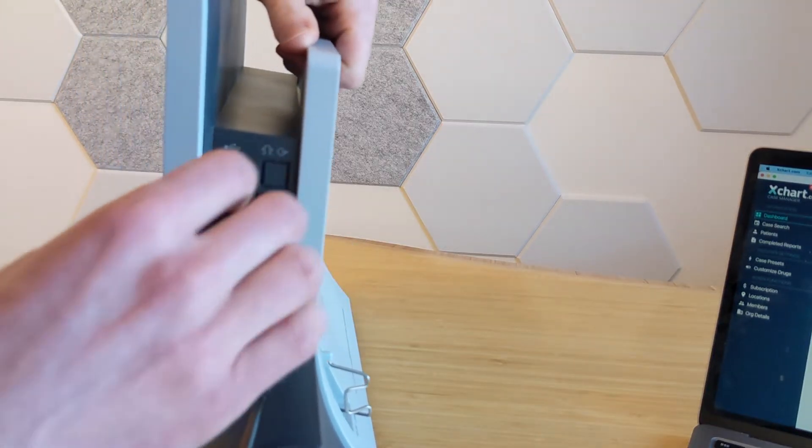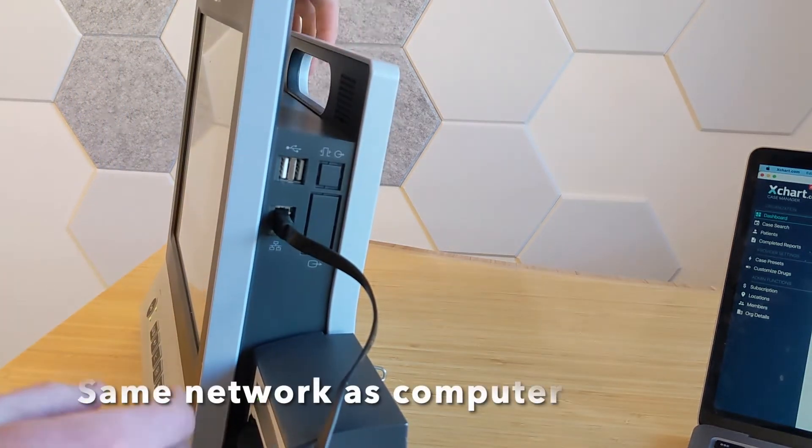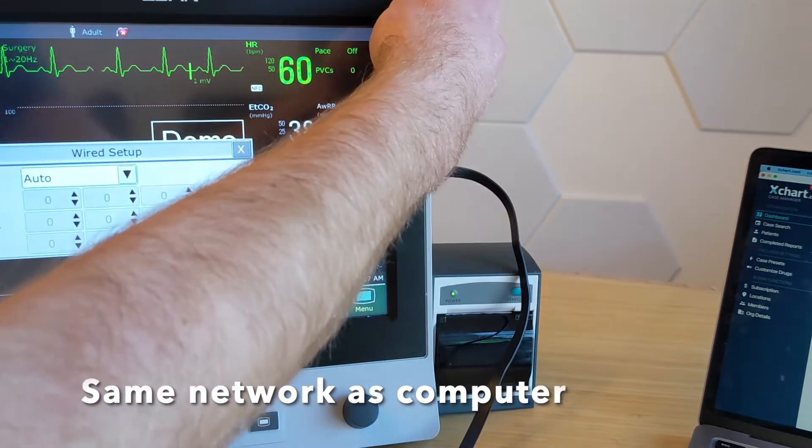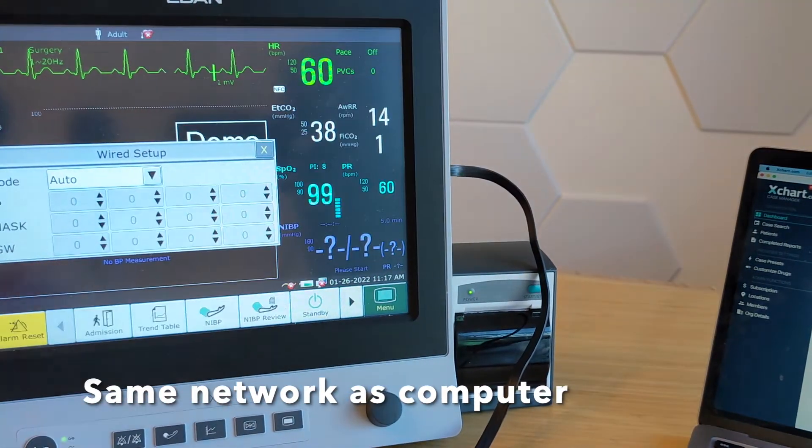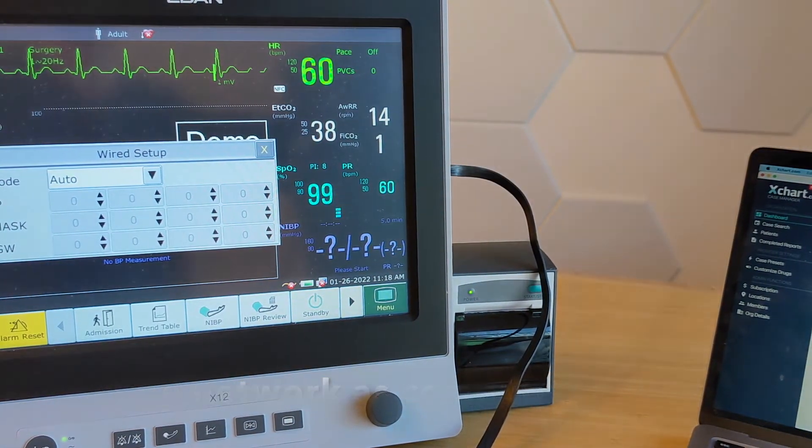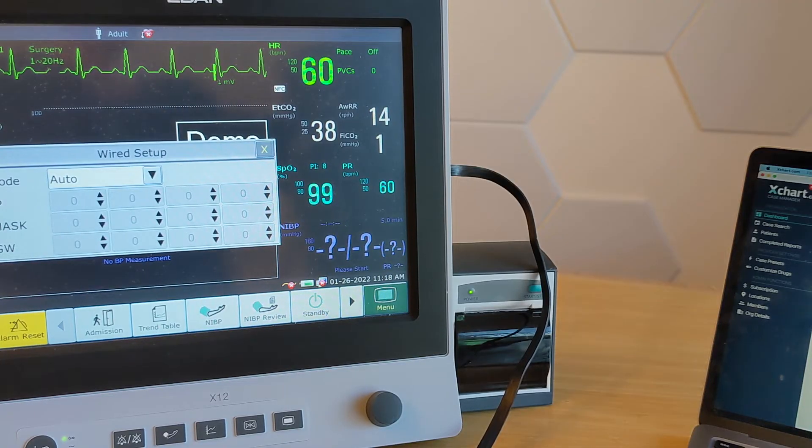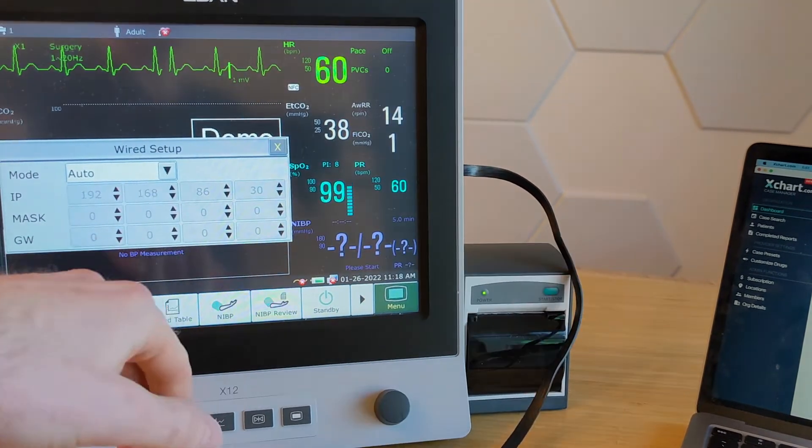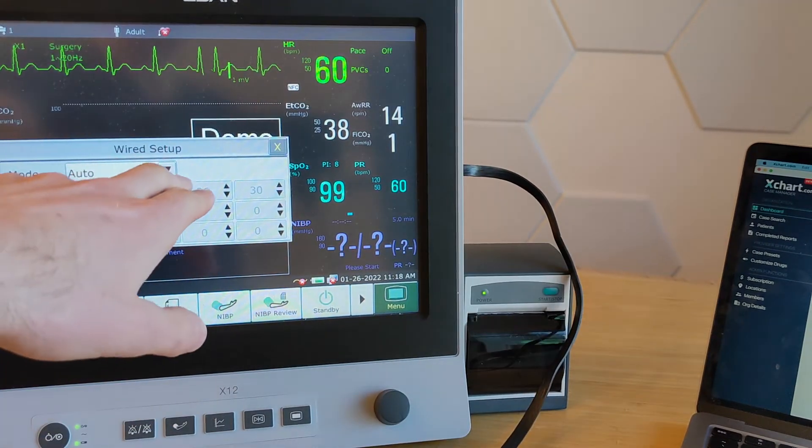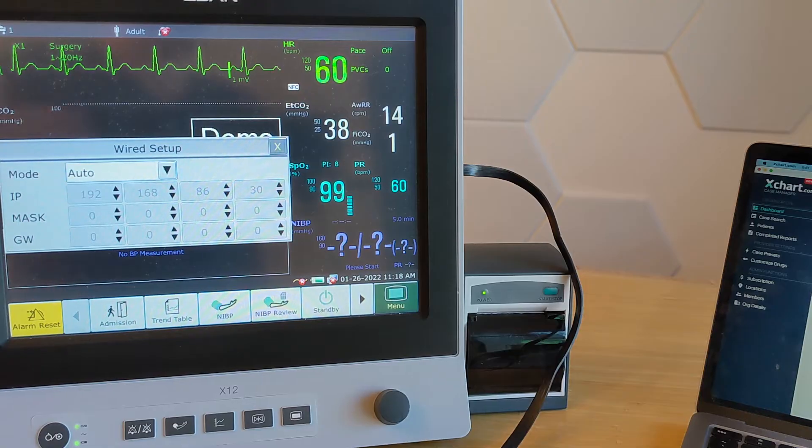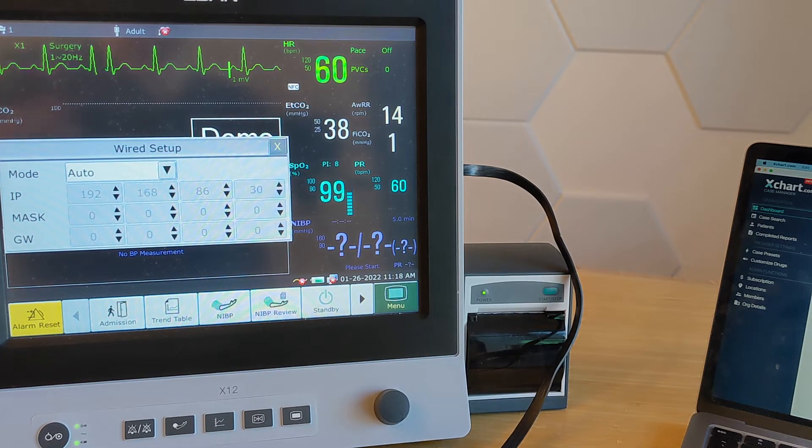You want to make sure that whatever network you're connecting to here is the same network that you're going to connect to whatever computer you're going to be using to chart. Obviously, it has to be on the same network for this to work. We can probably just leave it on auto. If you have a special network set up, you can do that.